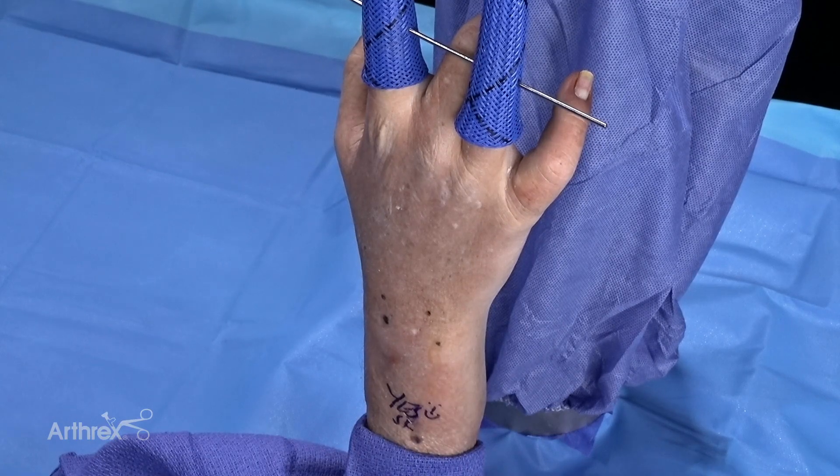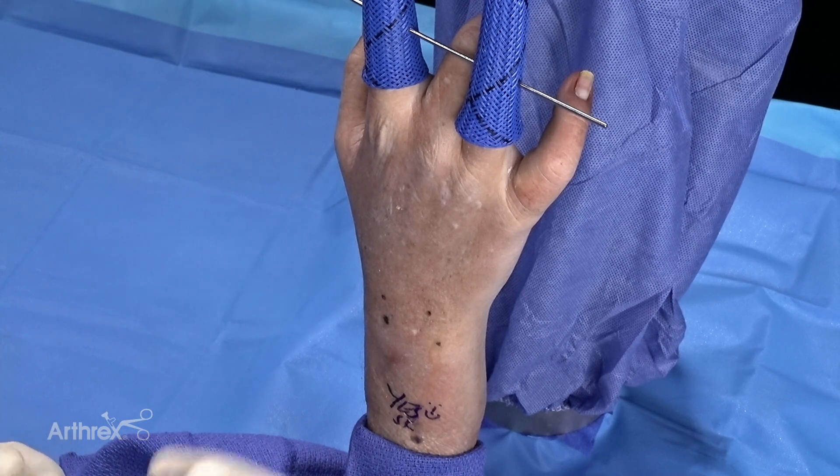Today we're performing a wrist arthroscopy, but nanoscope technology can be used not just for intra-articular pathology — for example, the wrist, the thumb CMC or MP joints, or the finger joints — but also for extra-articular pathology such as carpal tunnel, cubital tunnel, de Quervain's tenosynovitis, or trigger finger.